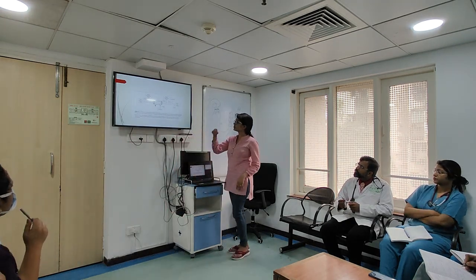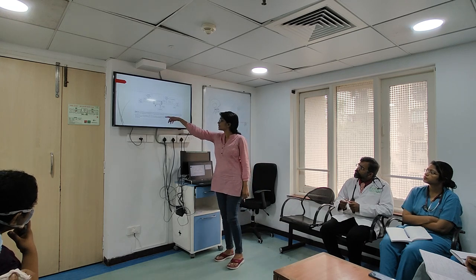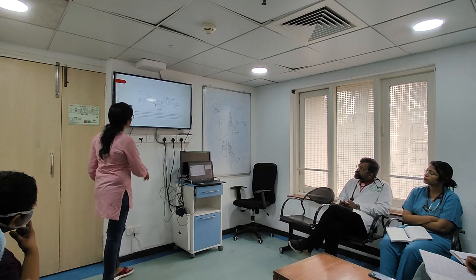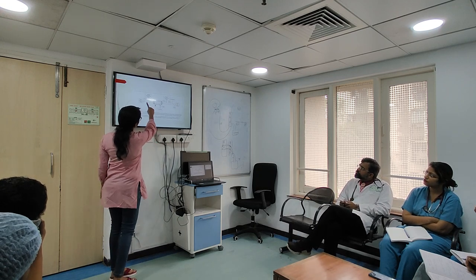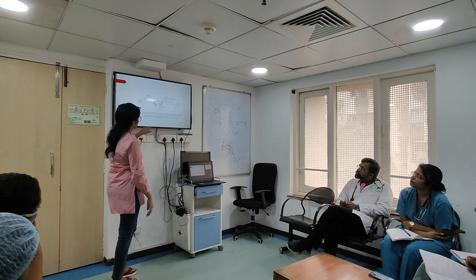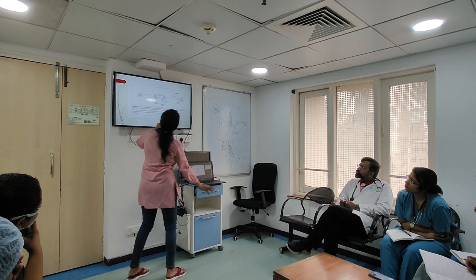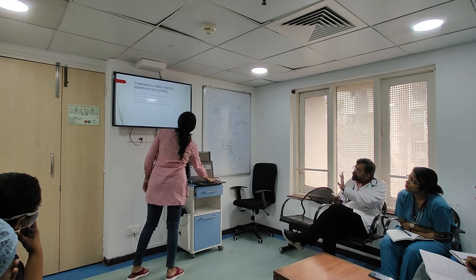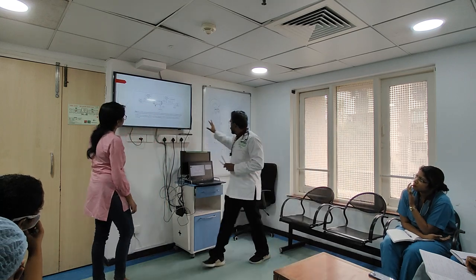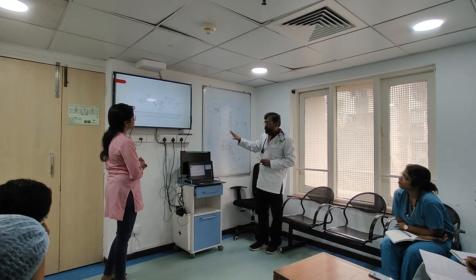This is continuous veno venous hemofiltration. In this, we are using the method of convection. The principle is convection, and we are using pre and post filter replacement fluids. So this is veno venous hemofiltration. Now let's go back. What she says is this is the same filter that I'm showing over here. You are saying that you are doing a CVVH, right?